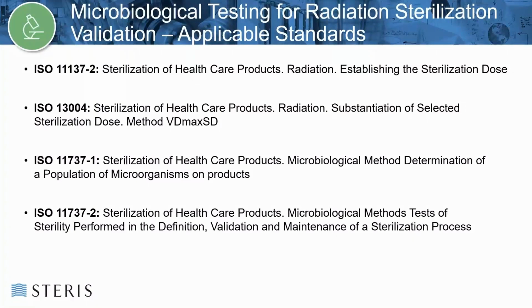The standard references for guidance on the radiation sterilization validation and associated microbiological tests are listed here. ISO 11137-2. In this standard, it guides us on the processes used to validate Method 1, Method 2, VD-Max 15, and VD-Max 25. ISO 13004 outlines additional VD-Max dose options from 17.5 kilogray up to 35 kilogray.